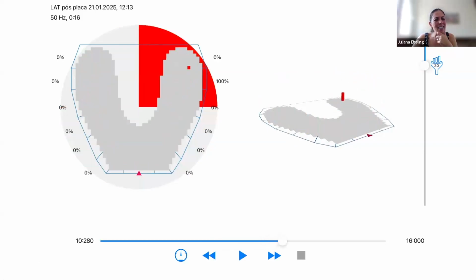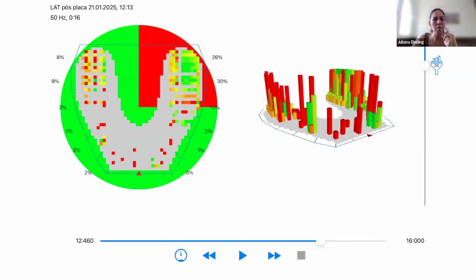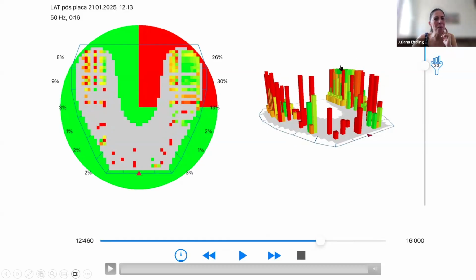I have a canine guidance, and it's pretty good, but you cannot see this interference in the balance side. And normally I have seen this situation: I have a canine guidance, but the intensity of the contact in the balance side is higher than the guidance.